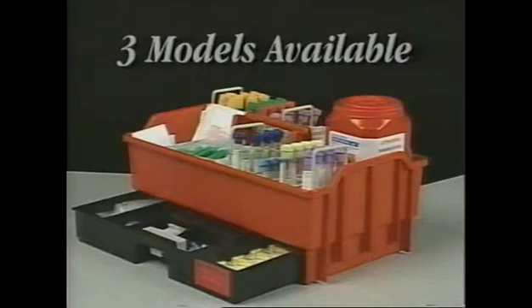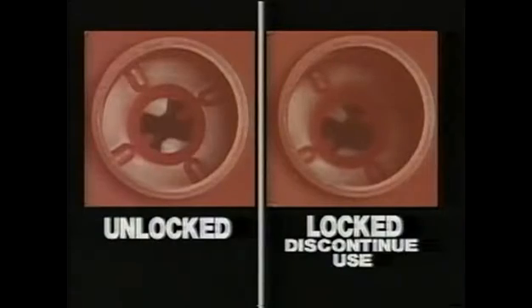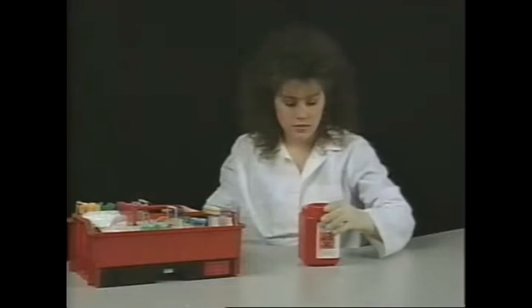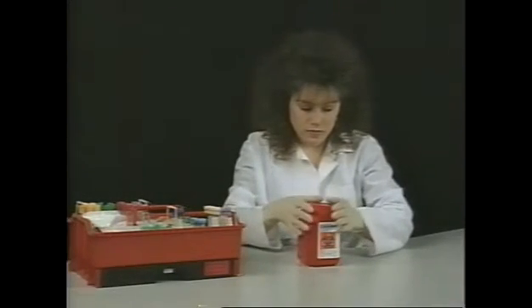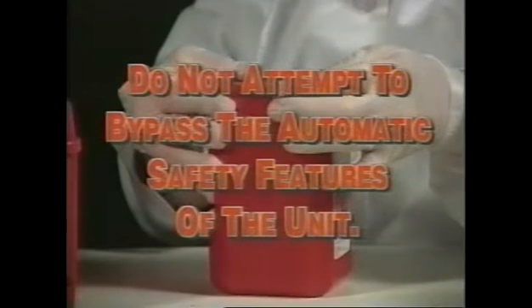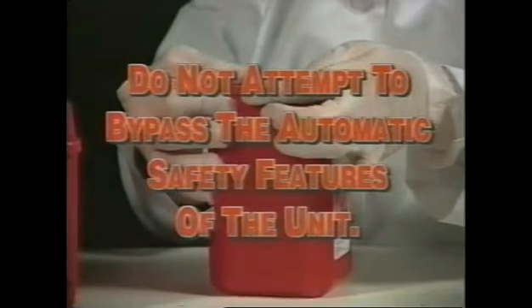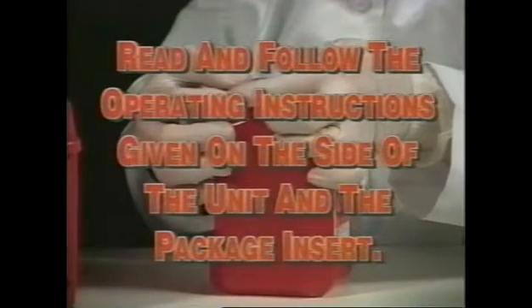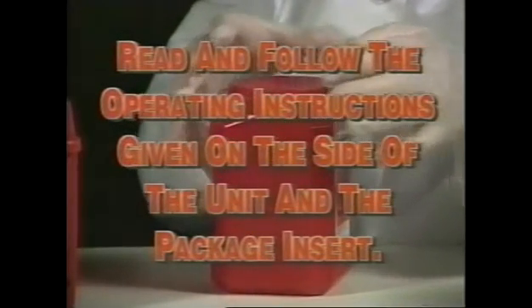There are three AND models available for each of the three leading blood collection needle manufacturers. Remember, when the automatic mechanism locks in the down position, discontinue use — the AND will not automatically remove any more blood collection needles. Remove the top cover from the side of the unit and seal firmly for disposal of biohazardous waste. Do not attempt to bypass the automatic safety features of the unit; they are designed for your safety. Read and follow the operating instructions on the side of the unit and the package insert to assure optimal performance and safety.